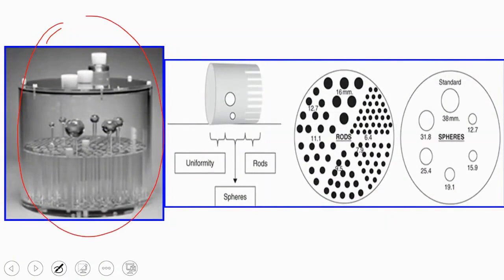The term phantom refers to the phantoms you have seen, which is made of a material called perspex. Inside it, we place distilled water, and there is a specific design whose purpose is to test my machine. We used to use a regular water phantom, which only contains water, but now we want to test a range of things. So, what do we test? I test the resolution, the uniformity, and the contrast of my system.